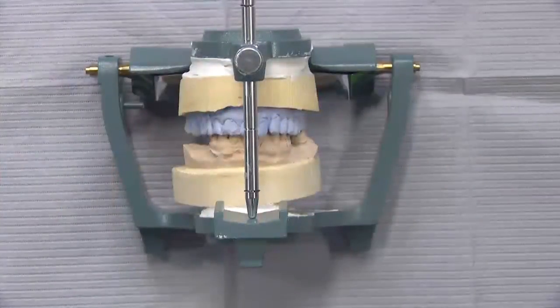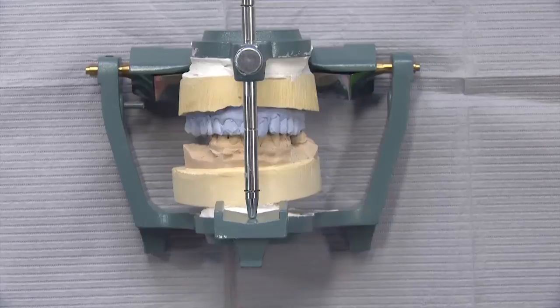As a laboratory, we're not huge fans of the H&H impression technique. We've mentioned it before in the case of the week. Some dentists will tell us that they're doing it and ask for extra coats of die spacer. Today, that means extra coats of digital die spacer, where we'll add some extra spacer. But a lot of dentists will do the technique and not say that, and we end up with crowns that are too tight and they won't go down all the way. And we also have occlusal issues, like what we'll see on this case.